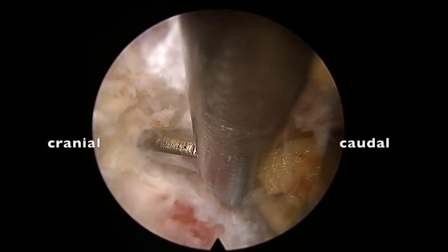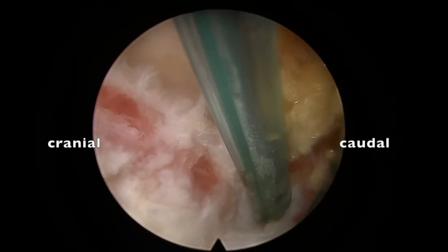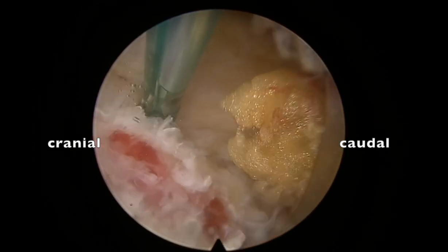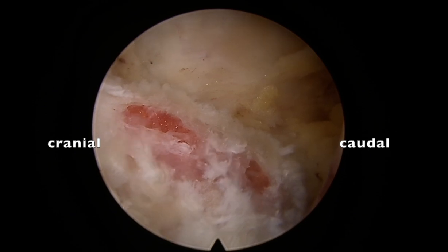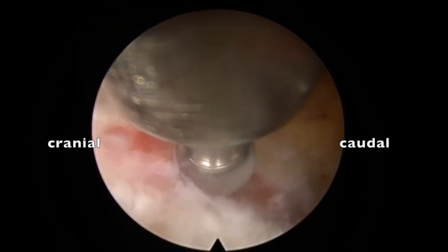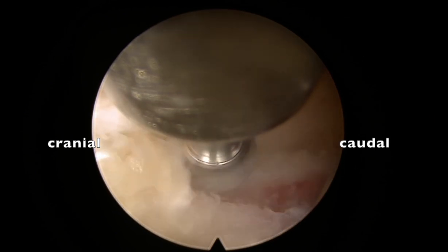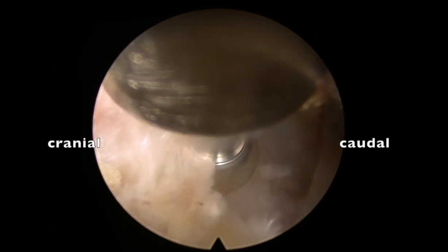I'm clearing the tissue, clearing the edge of the inferior facet — that's the inferior-most part of the inferior facet. As we go superiorly, it continues as lamina. I start drilling at the inferior-most part of the inferior facet. Once you drill, it goes superiorly — drill the facet-laminar junction and the lamina.